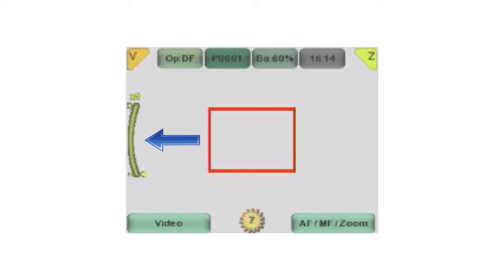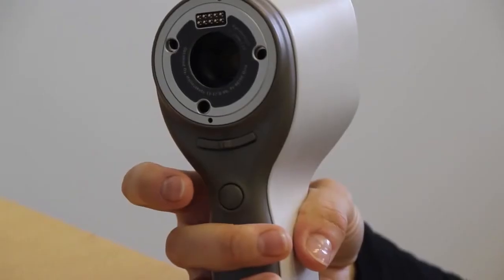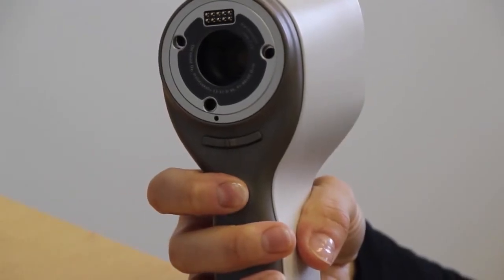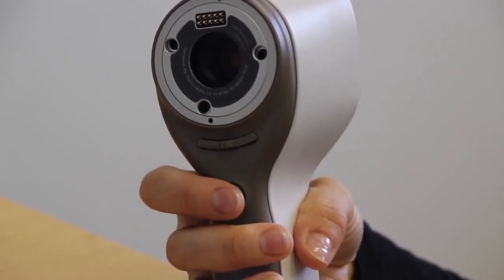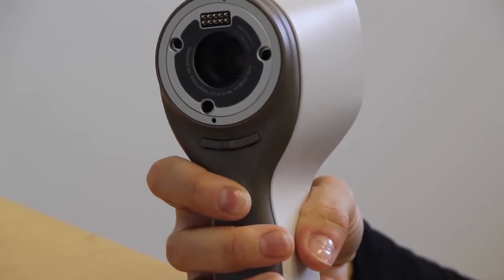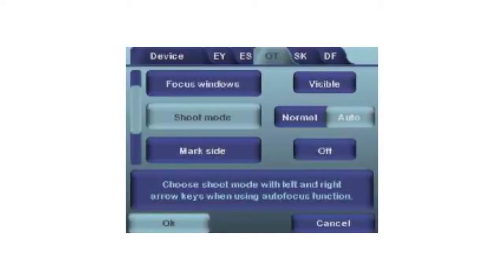We will now look at the other menu options. Shoot mode. With autofocus, there are 2 shoot modes you can select from the OT menu: normal and auto. With the normal shoot mode, the shutter button operates like a standard digital camera with a step trigger. Pressing the button halfway down first focuses the image, and the image is taken when the button is pressed all the way down. With the auto shoot mode, you will only need to press the shutter button halfway down, and the camera will automatically focus and take the image.